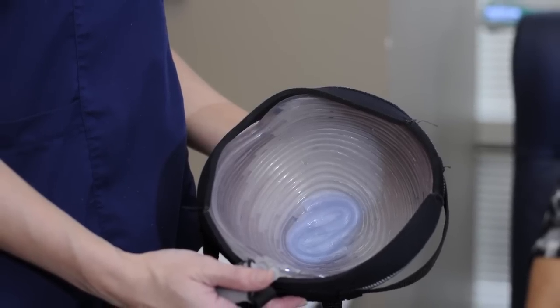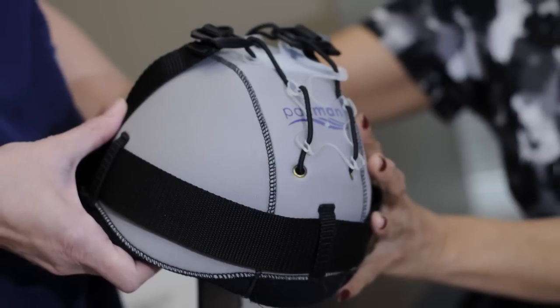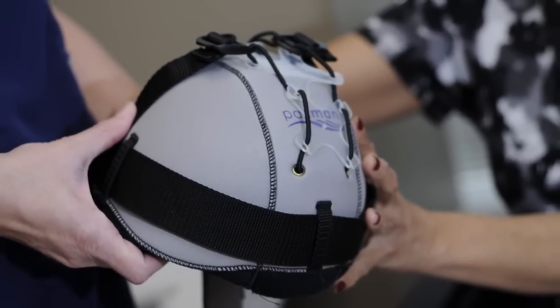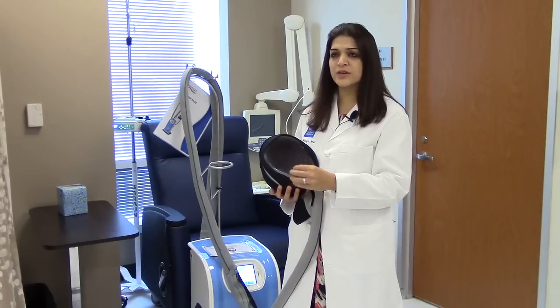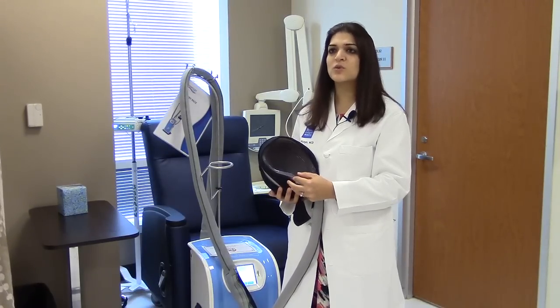Currently there are five different sizes from extra small to extra large of both the inner and the outer cap. When the patient comes in before they start treatment, they're fitted for each size, and that's the size they'll wear throughout treatment.